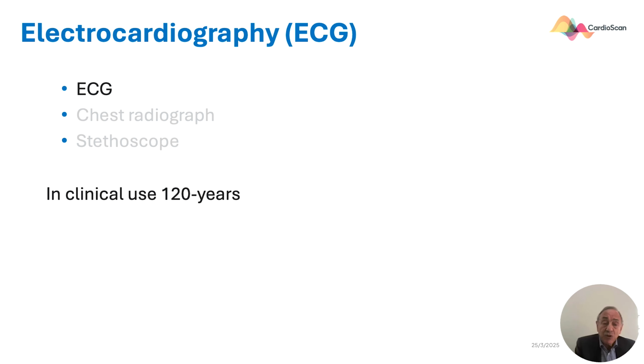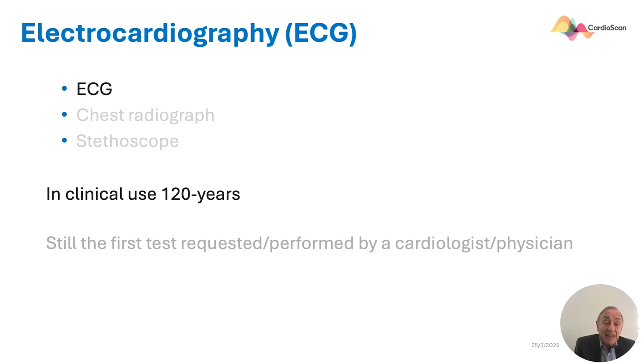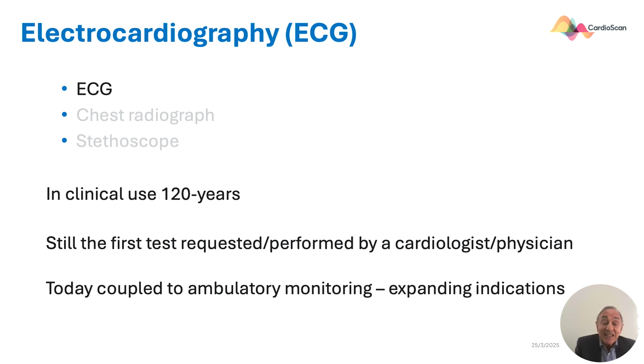It's been in clinical use 120 years. It is still the first test requested and performed by a cardiologist or physician, and today is coupled to ambulatory monitoring with ever-extending indications. So the electrocardiograph has remained an extremely important tool in cardiology, but is often not given much emphasis in teaching and training.